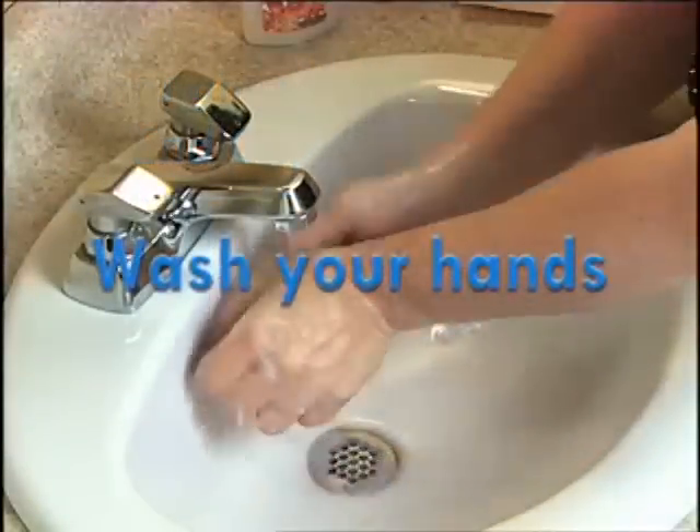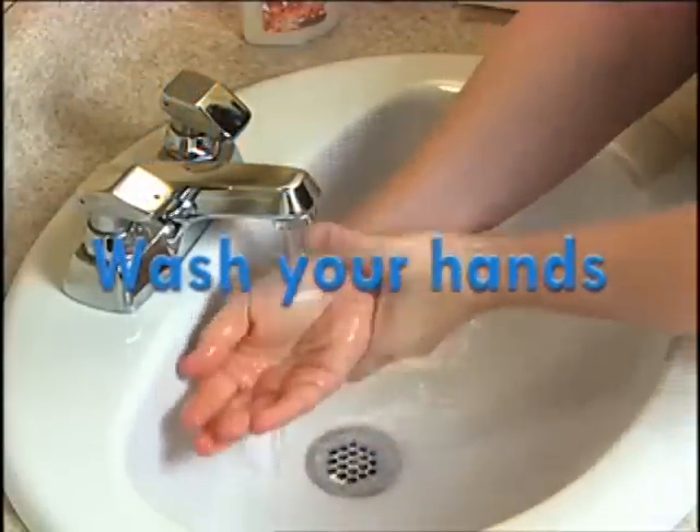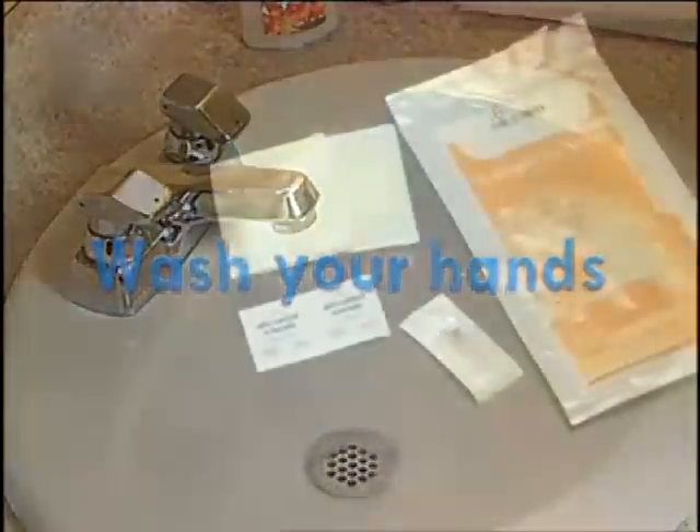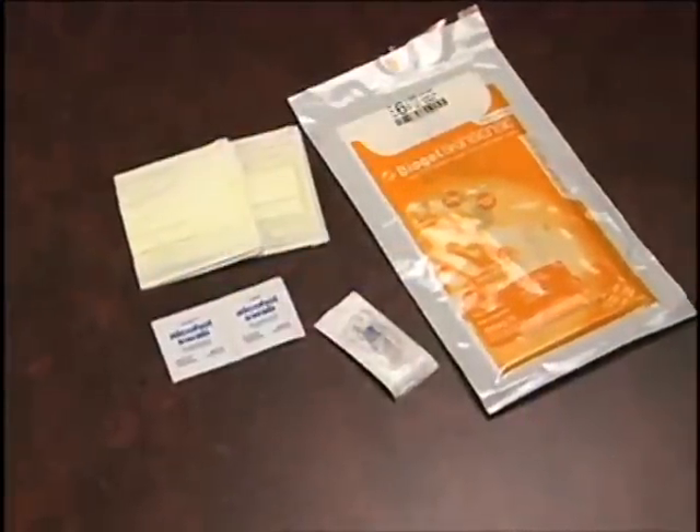As always, before caring for your line, thoroughly wash and dry your hands. Gather the supplies you will need.